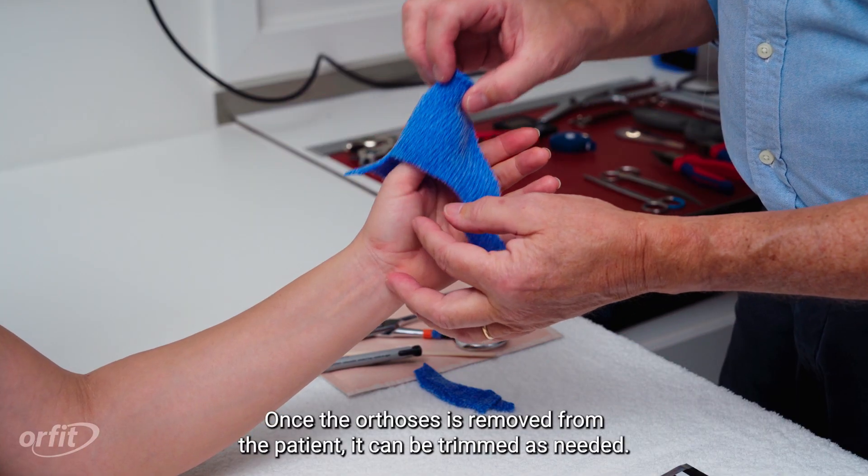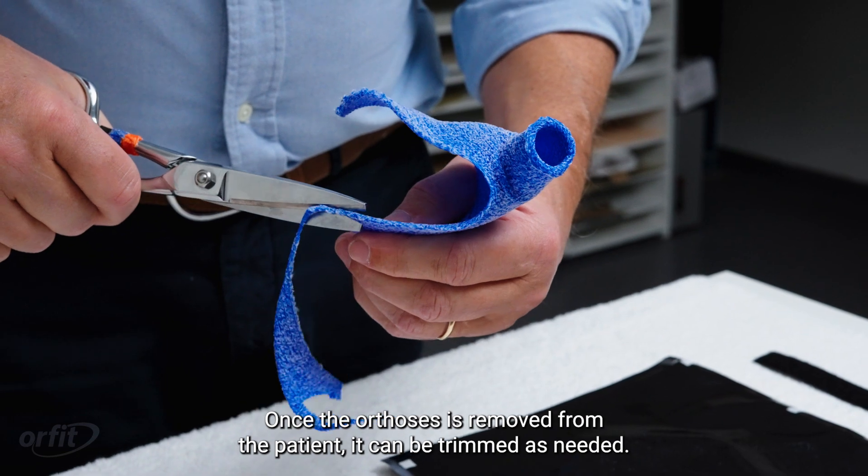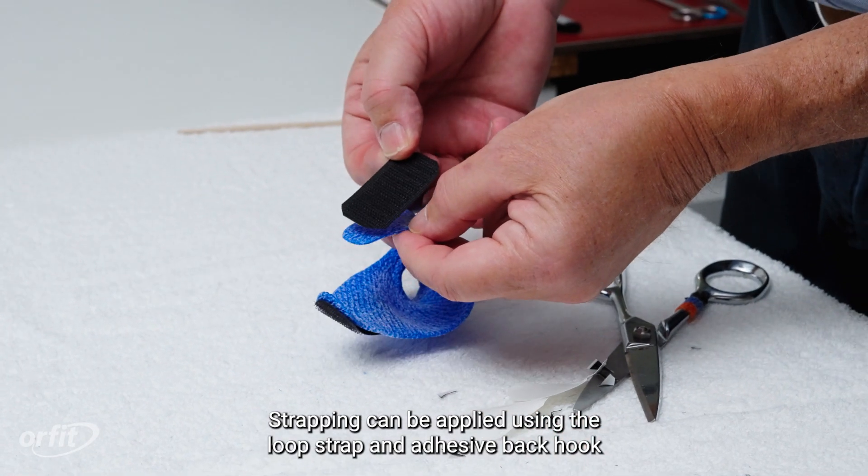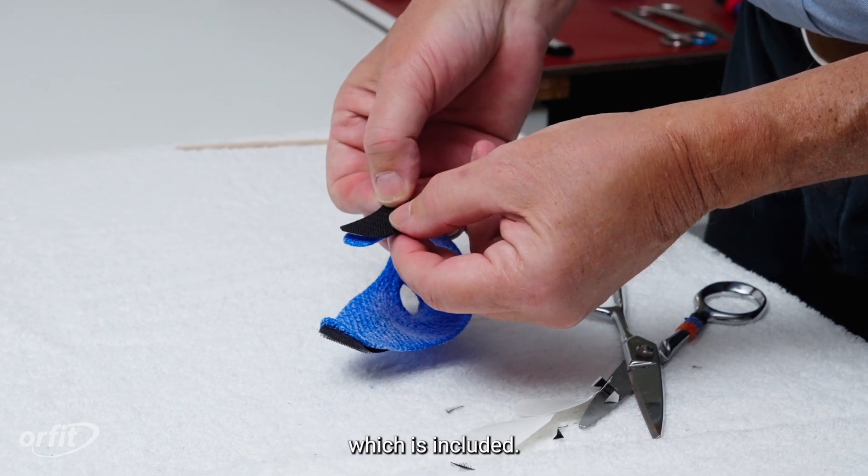Once the orthosis is removed from the patient, it can be trimmed as needed. Strapping can be applied using the loop strap and adhesive back hook, which is included.